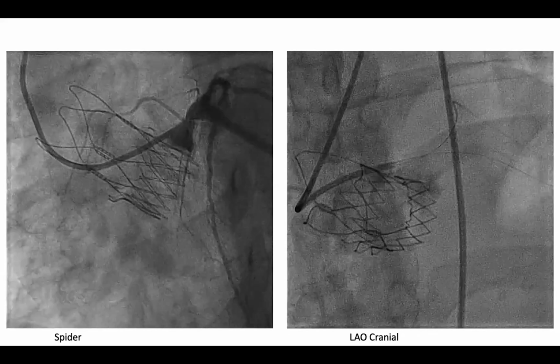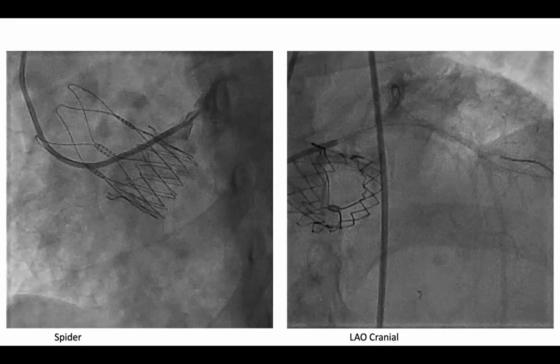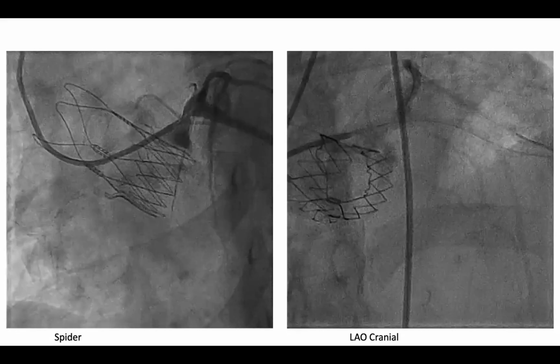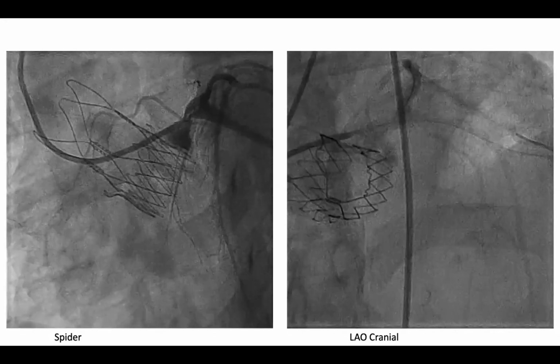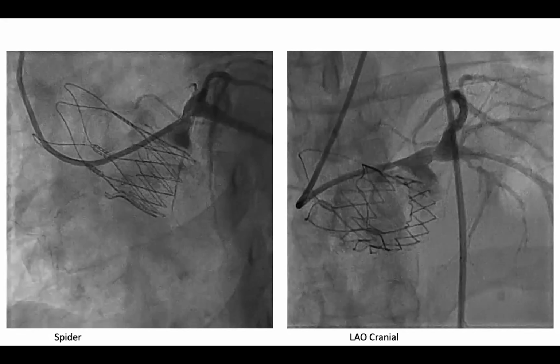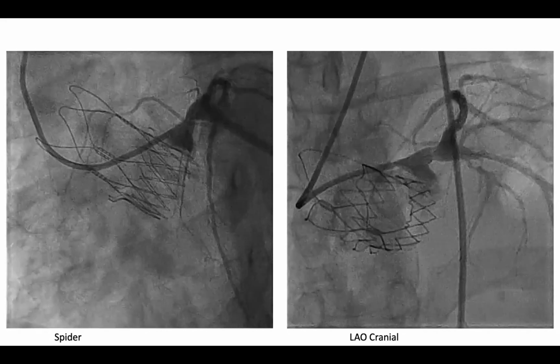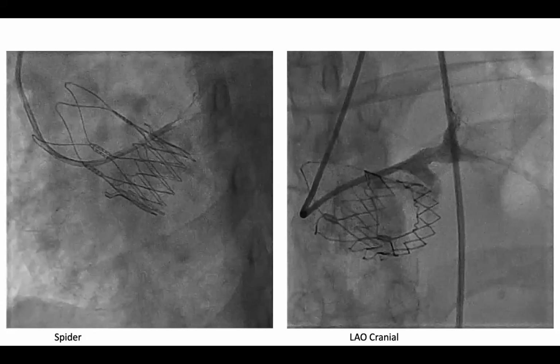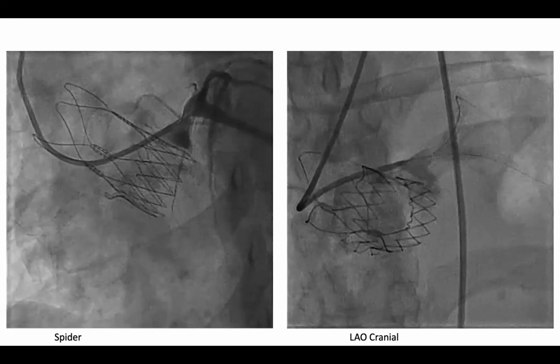Before we come to your poll question, there's a question in the chat box from Lal Mughal: what was the invasive blood pressure rather than the actual initial A&E blood pressure? Throughout the case, from as soon as we got the first catheter in, the blood pressure was never more than 90 systolic. Was the lactate high? It was ranging between 80 to 90 systolic. And the patient was quite nauseous and she was twisting and turning. So she was in pain.